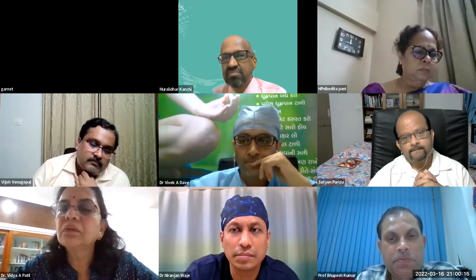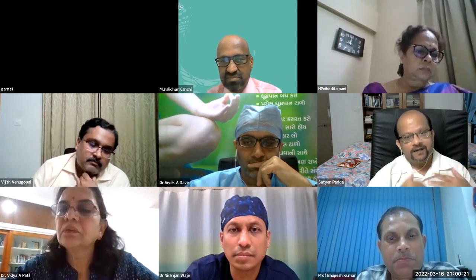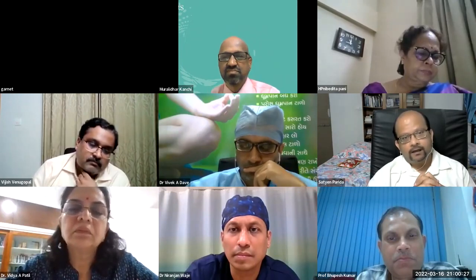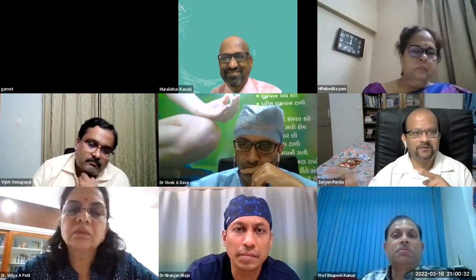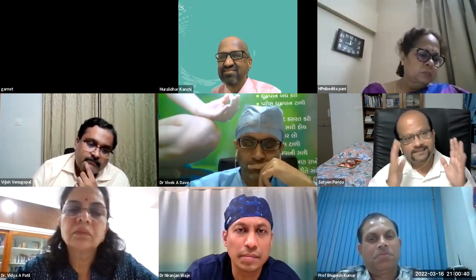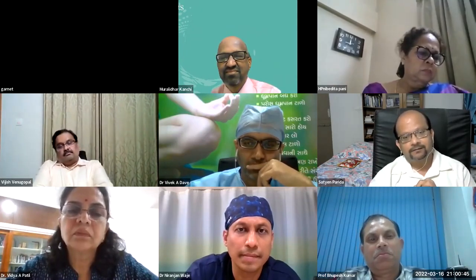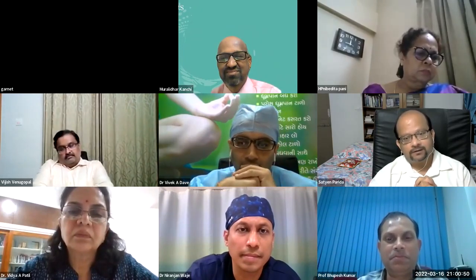in different surgical settings. My general view was that whenever the blood pressure actually started dipping down, the hypotension prediction index went up. Now, if I'm looking closely at the monitor, I don't need the hypotension prediction index to tell me that the BP is now close to 65, and in the next 5 minutes it's going to go below 65. But then again, I have not conducted a systematic study of the device. That kind of a systematic study would be required before a final judgment could be passed on the HPI.